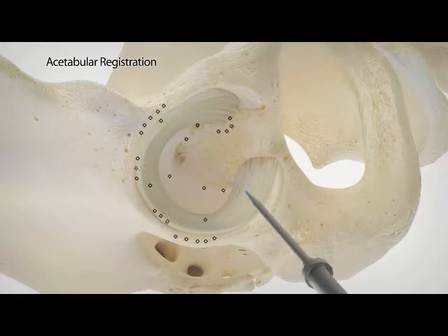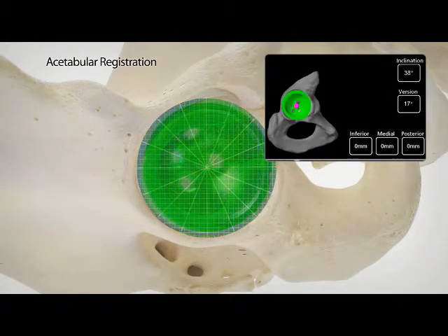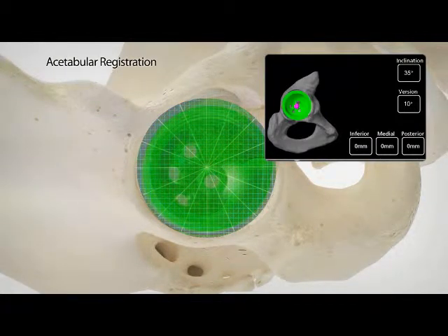Utilizing the femoral version, the orientation of the acetabular cup can be intraoperatively adjusted to provide the optimal biomechanical reconstruction that is specific for each patient.